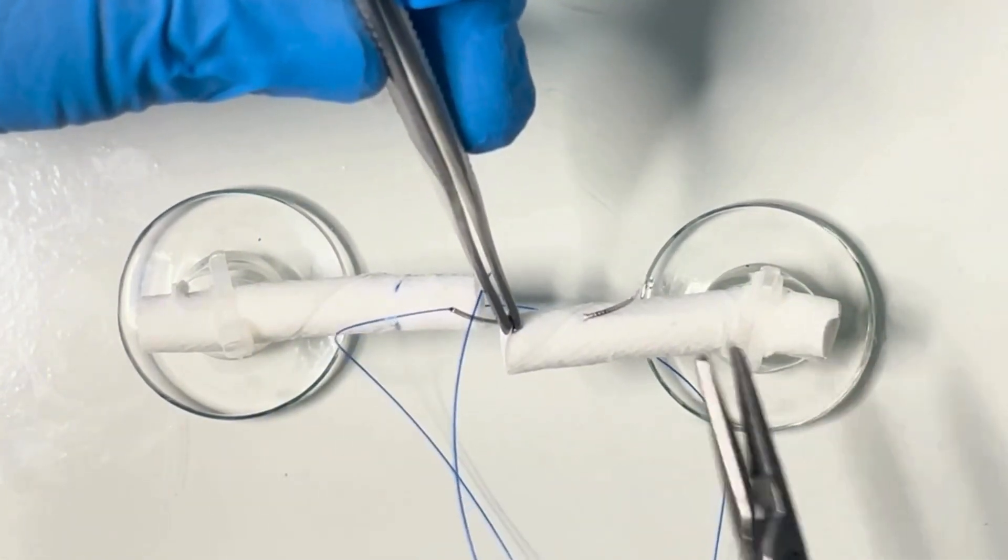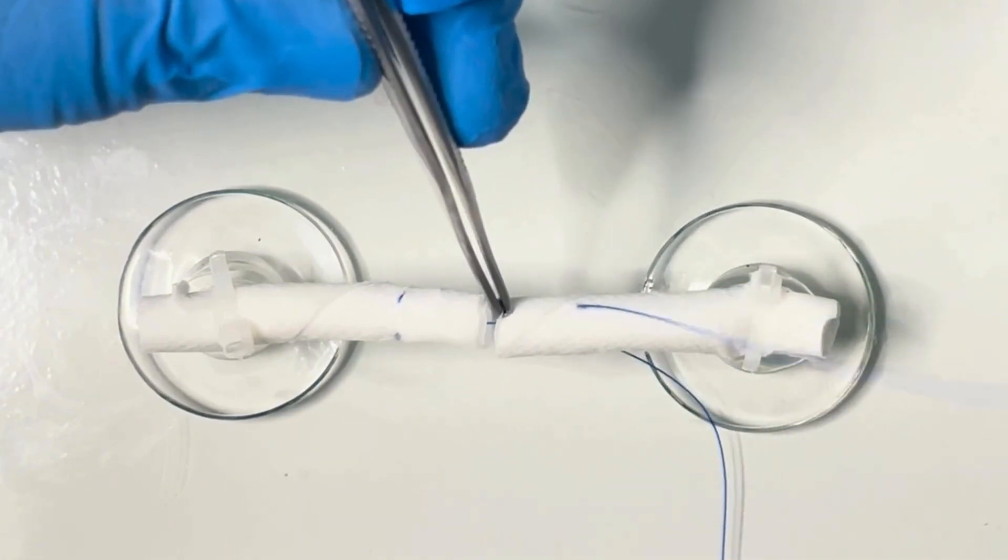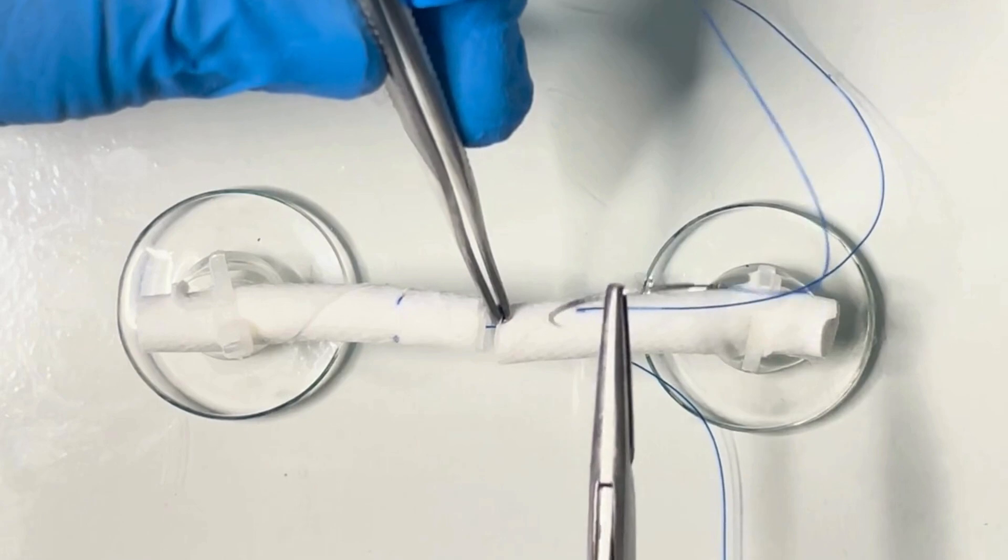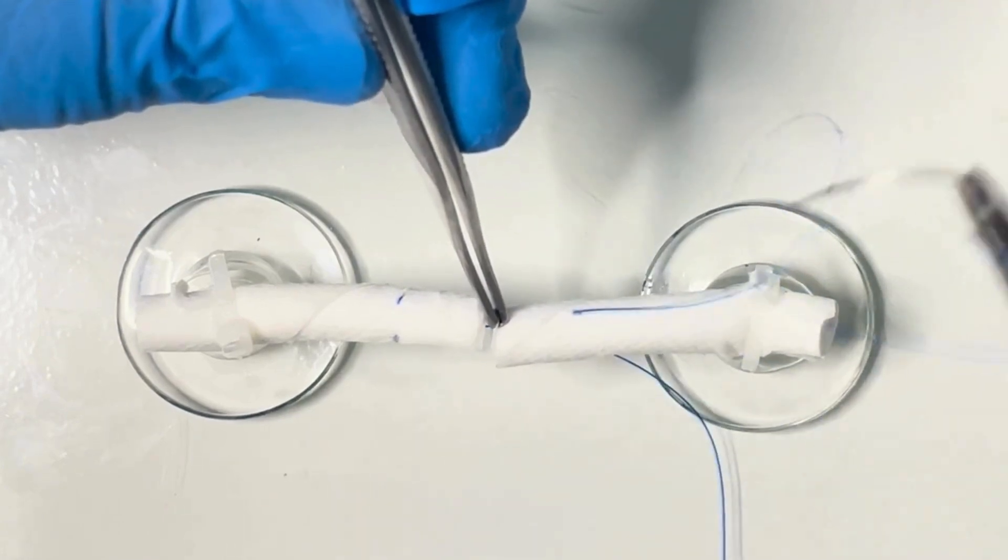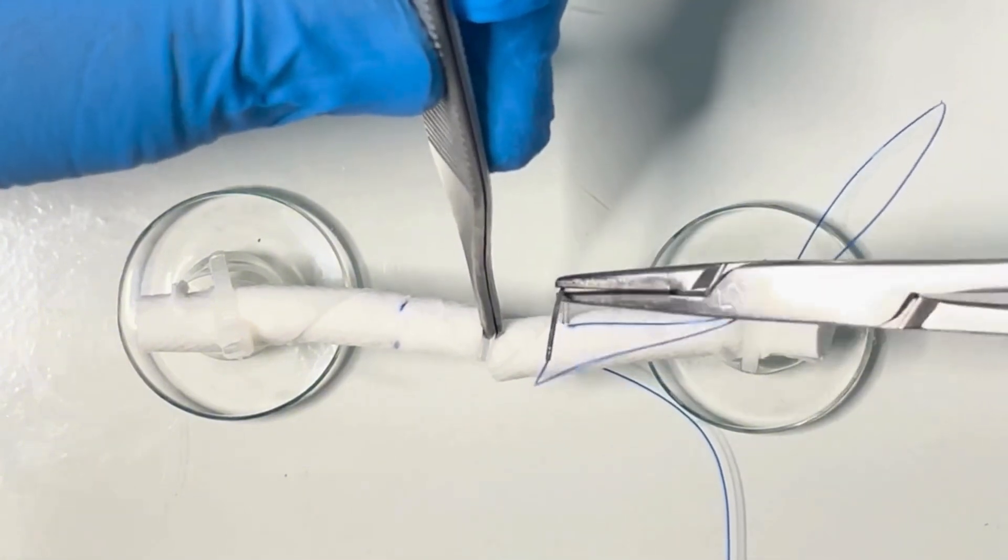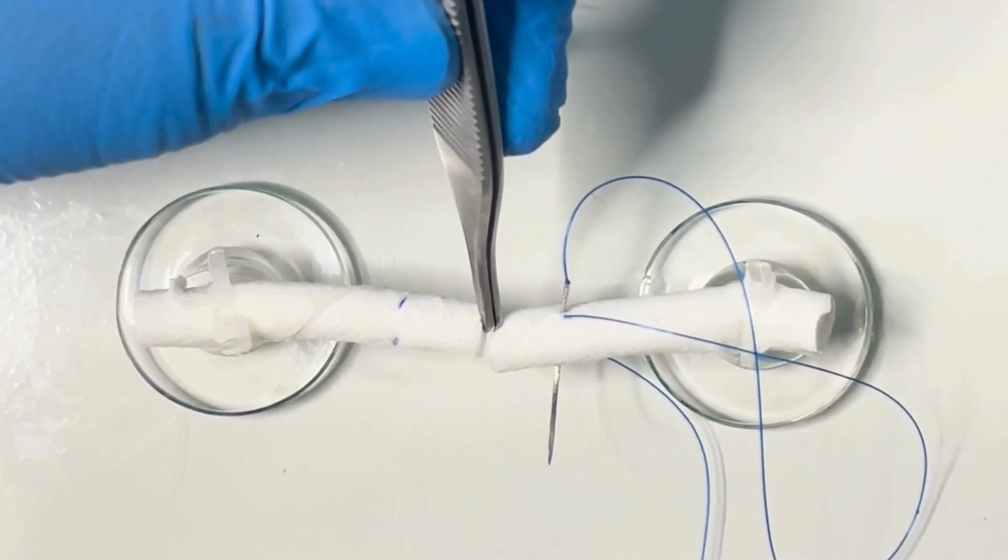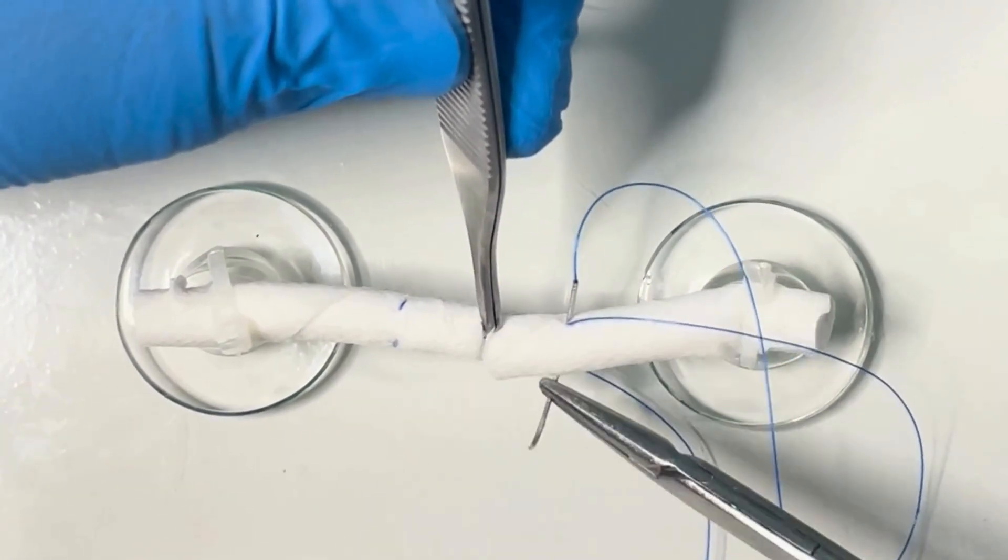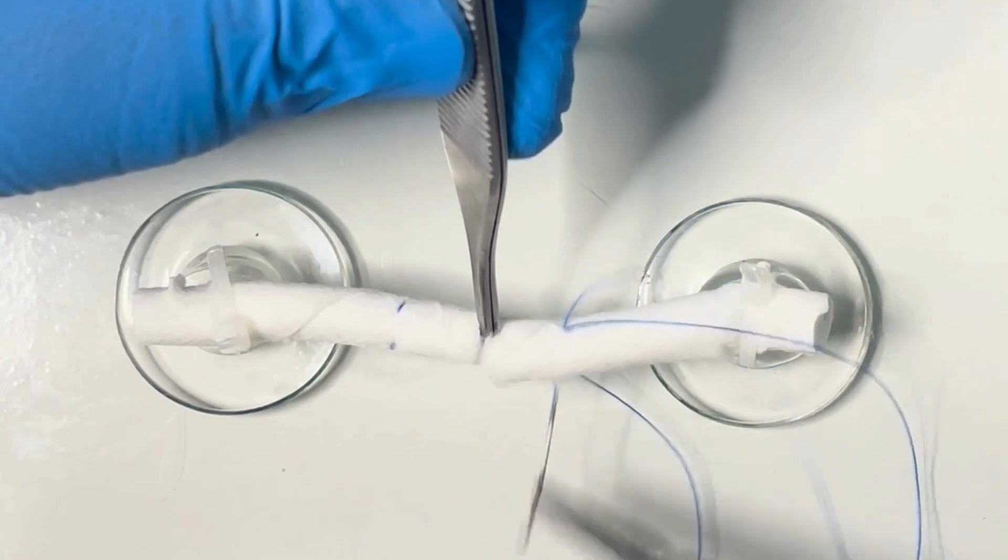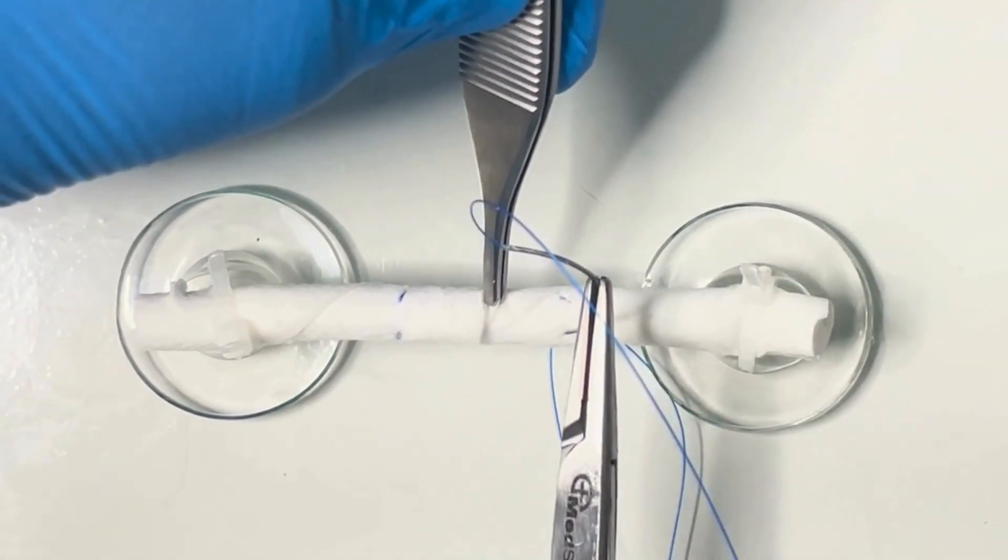Repeat these steps. A straight bite one centimeter in length. Suture across the width of the whole tendon. A straight bite ending back in the middle of the two cut ends.